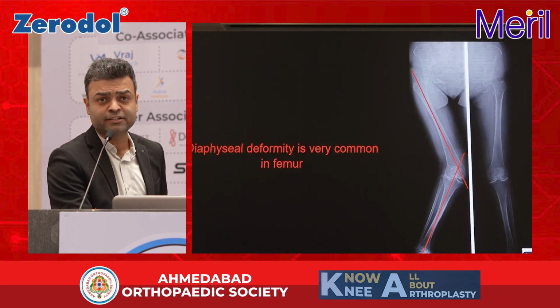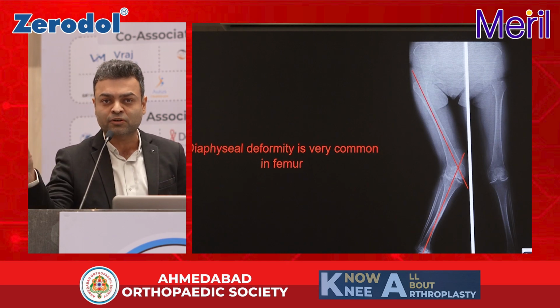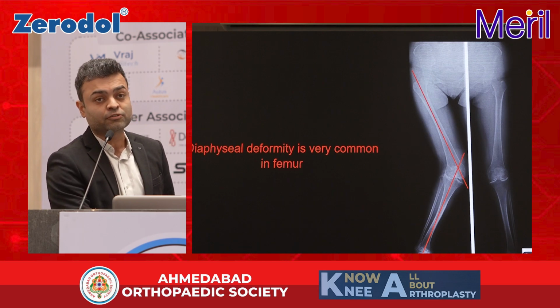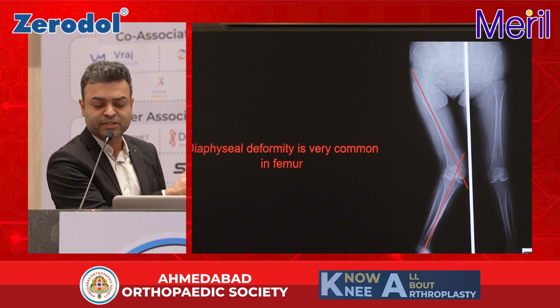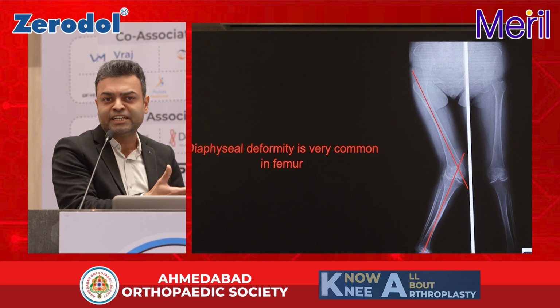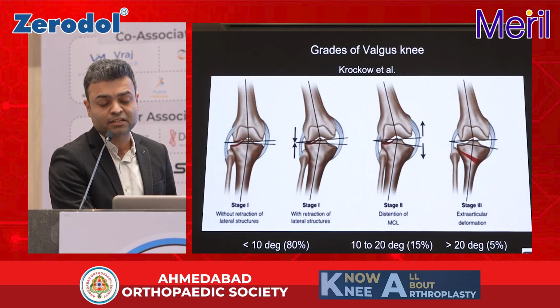That's the diaphyseal deformation that I'm talking about, which is always secondary to the soft tissue contractures. Even the external rotation torsion deformities in these patients are secondary to the soft tissue contracture. So when we are doing a manual knee in these patients and you're using an intramedullary femoral rod to get your distal femur resection, you might need to start slightly medial on your entry near the PCL insertion and not in the center of the intercondylar notch. So that is a technical message.